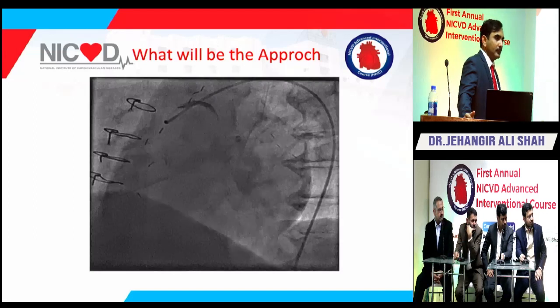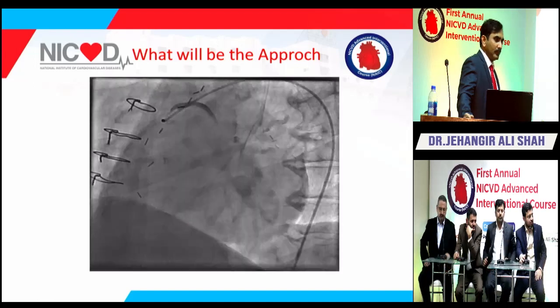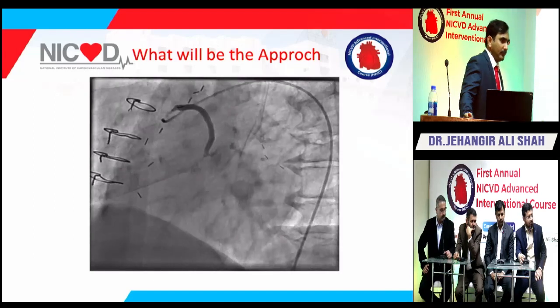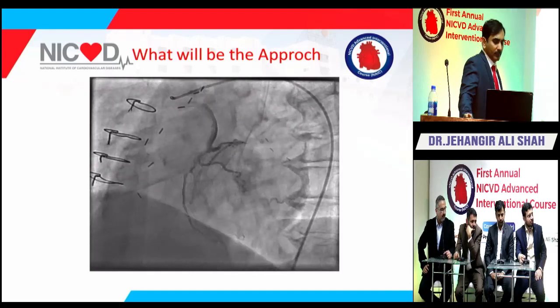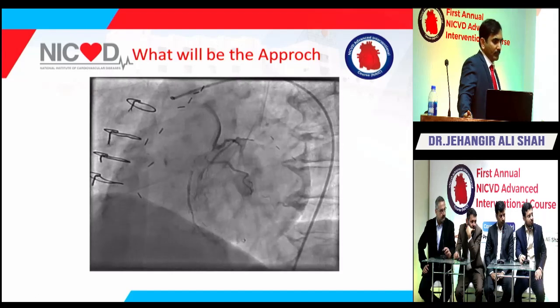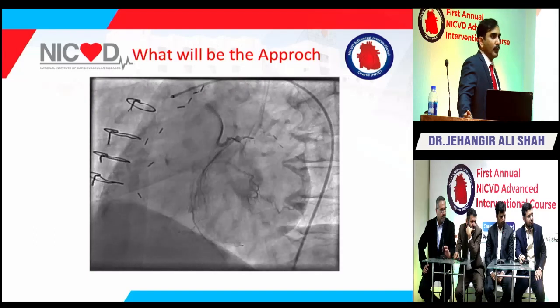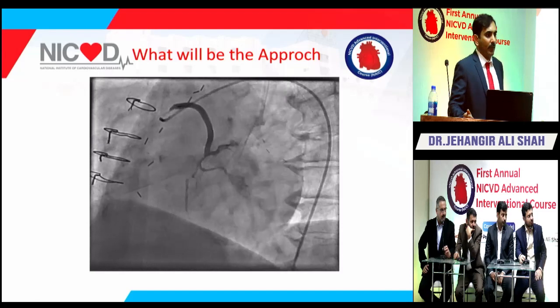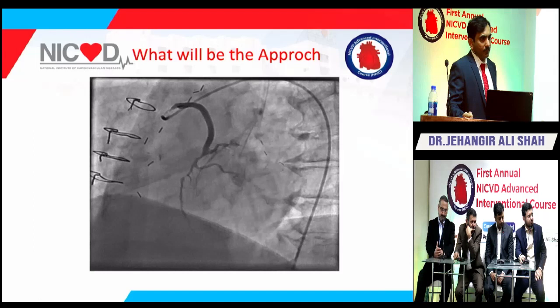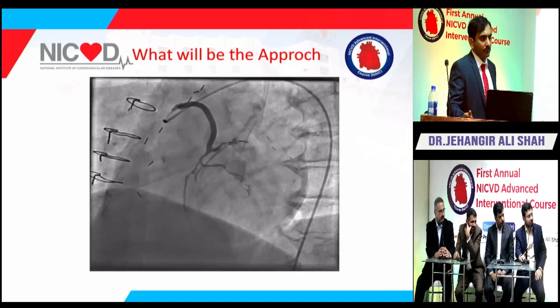There are two exceptions to the use of embolic protection in SVGs. One is ostial disease, because the pathology is very different. They're not lipid rich, they don't have macrophages, they don't have clotting. That's the first thing. And second is the insertion site, where you need at least a 30 to 40 millimeter landing zone. That is a non-issue here. But because it is predominantly ostial, I don't think you would be penalized if you were not to use it.